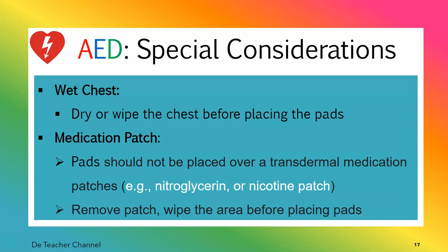Wet chest. If the chest is wet, you dry or wipe the chest before placing the pads. Okay. There are also people that have a medication patch like a nitroglycerin or nicotine patch. In that case, never place a pad directly over the medication patch. You have to remove that patch and wipe the area before placing the pad.